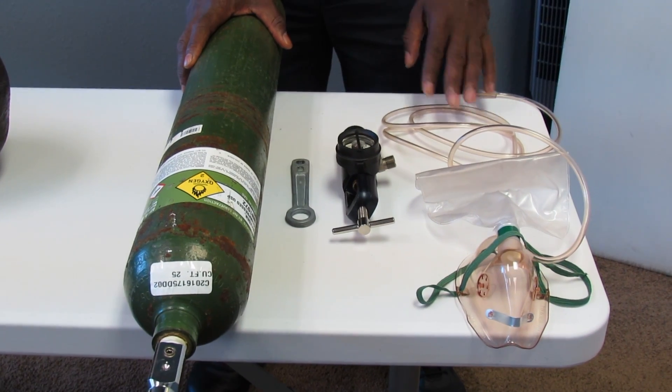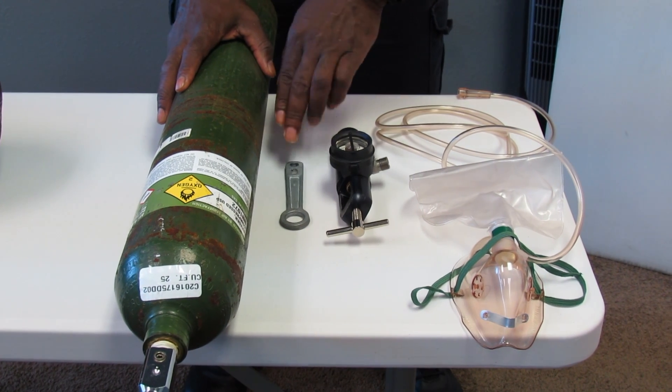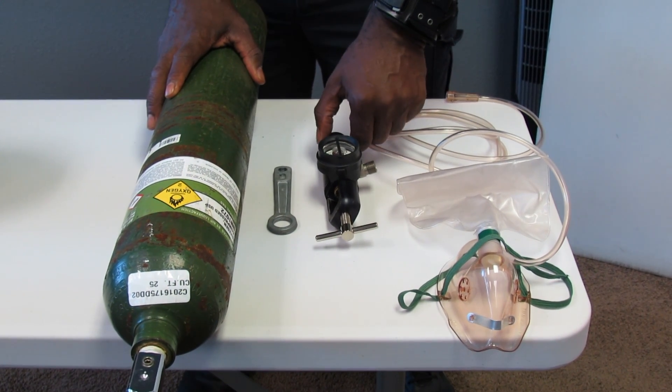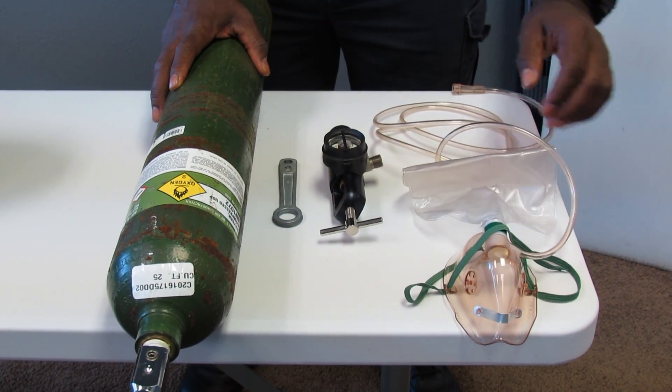Take or verbalize appropriate body substance isolation precautions. You want to gather your appropriate equipment: a full oxygen bottle, an oxygen key, an oxygen regulator, and a non-rebreather mask with a reservoir and tubing connected.